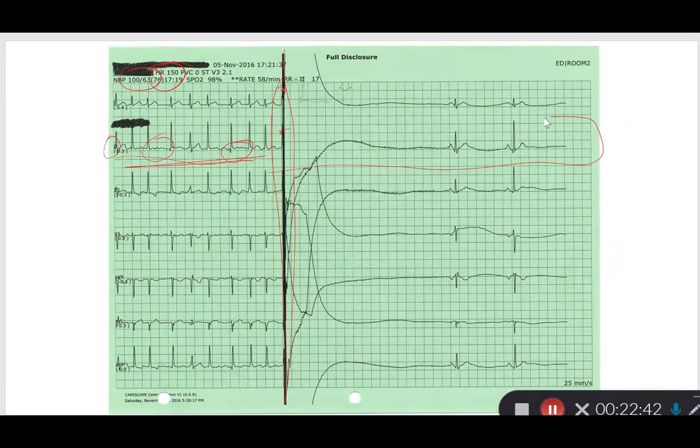So again, we're looking at lead 2. So we do get a pause there, which is very nerve-wracking. Usually we do sedate our patients for these procedures so they don't feel it. But you can see when we come back, we go into a beautiful sinus beat here and here, and they went on to be in a normal sinus rhythm. We got a nice P wave, QRS complex, and a normal T wave. And then we even get a little bit of stronger beat where we got that nice P wave, QRS, and a T wave. So that's one way we can help fix AFib, and we typically only do the cardioversions if medications aren't working.